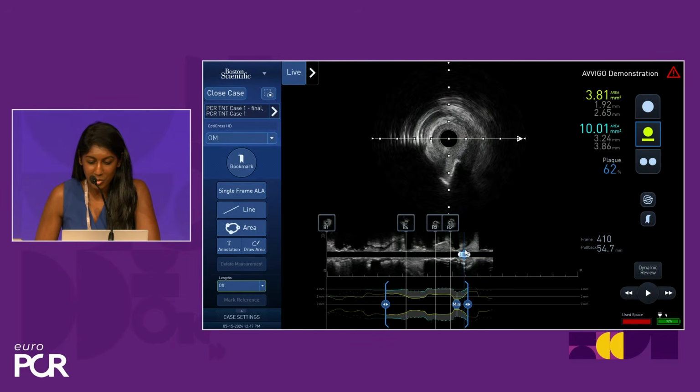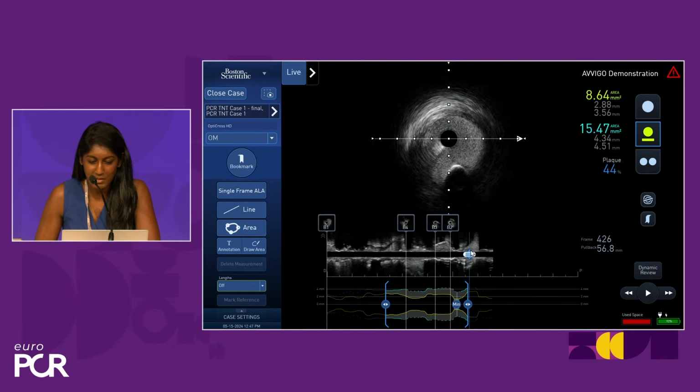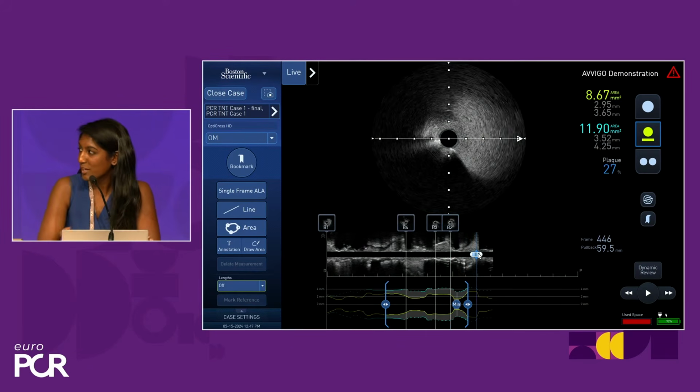And then as you come back from proximal circ into left main, you see down here at 6 o'clock a nodule of calcium. What's important to note is that the wire is biased away from that, so your rotor burr would have had absolutely no effect down here, but it's actually quite a large lumen. So that's sort of the effect of rotablation. So I think you could probably say that the rotor's had an impact throughout the burred part of the vessel.